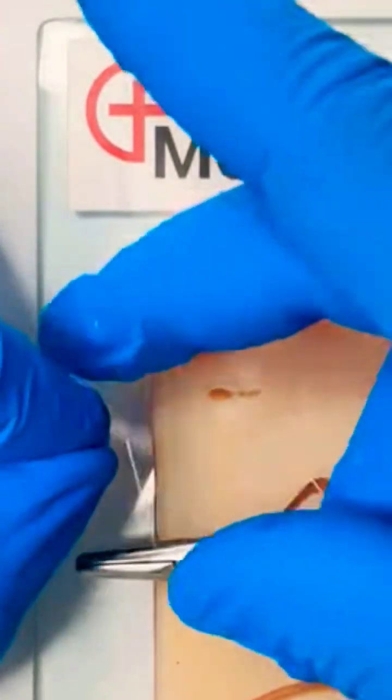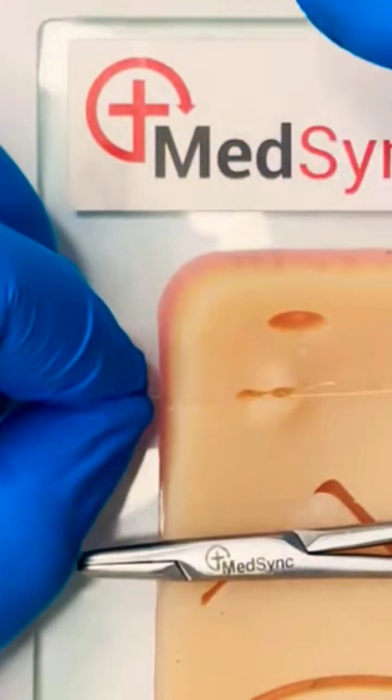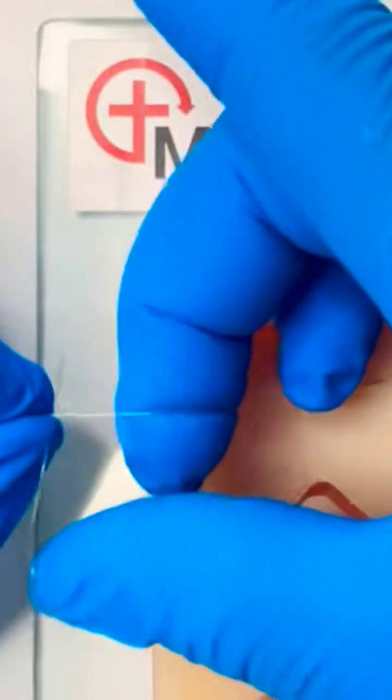This process is repeated four to six times for a monofilament, three to four times for a braided suture.